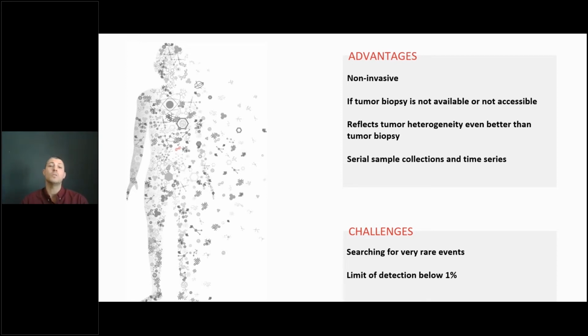Then one could use liquid biopsy, and also it has been shown that the heterogeneity of the tumor is even better reflected by liquid biopsy than just by a tumor biopsy. And also very important, we are able to take serial sample collections and time series.